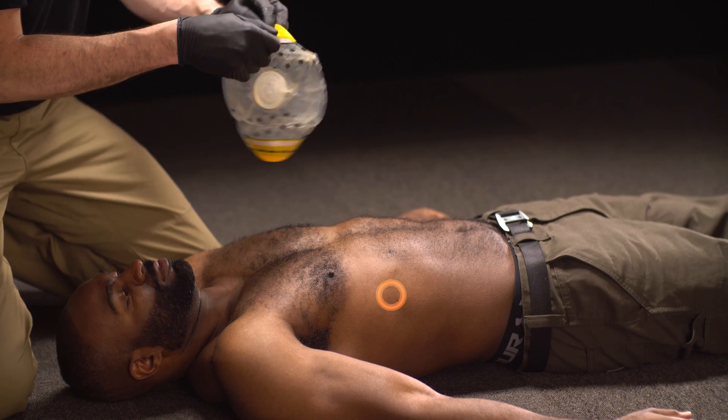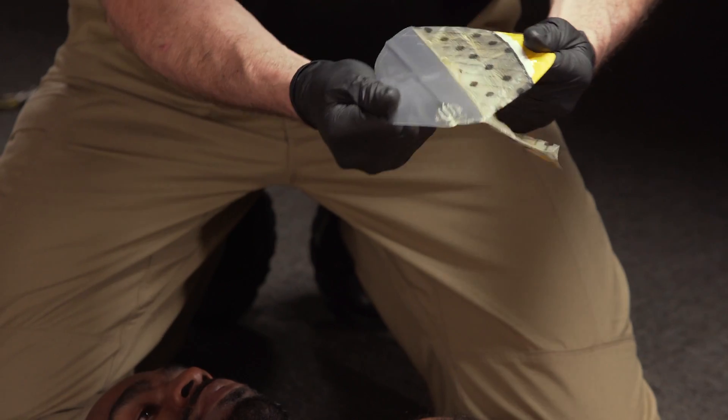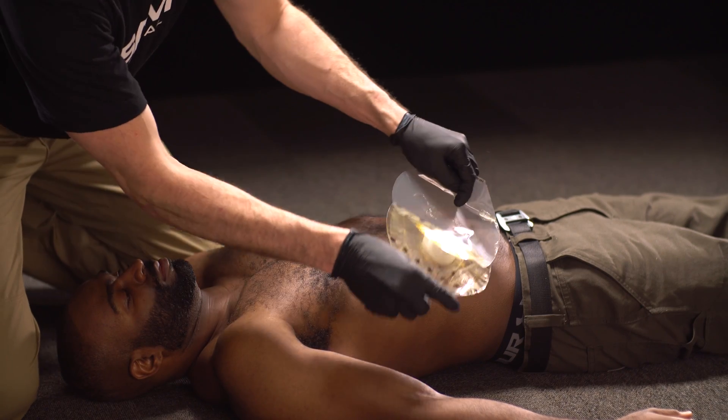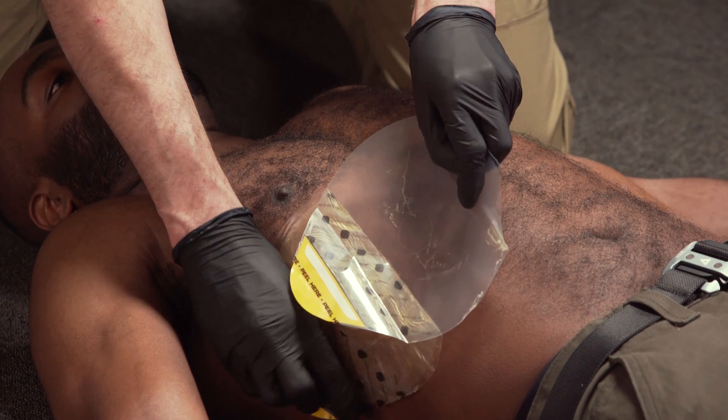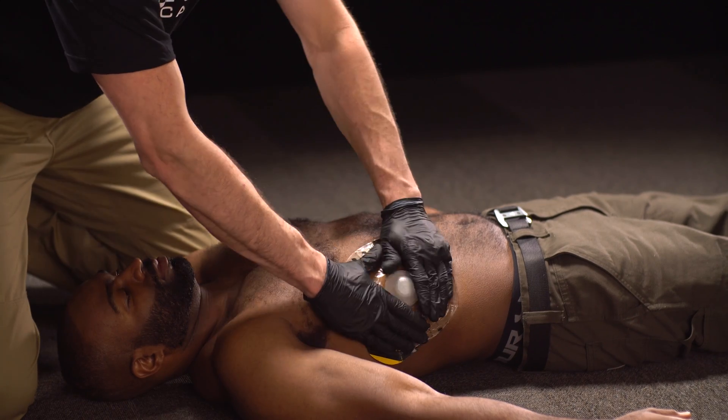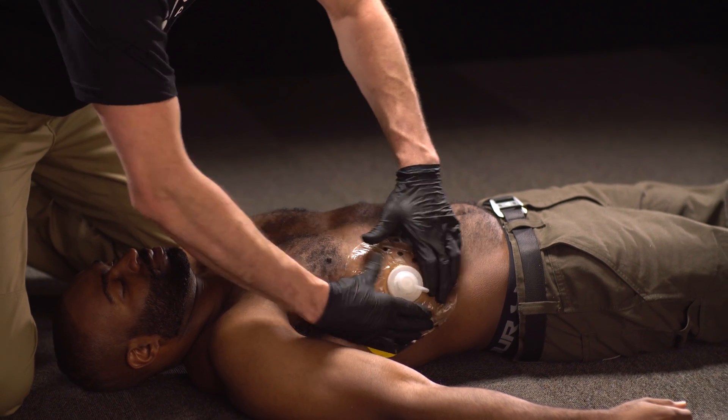Next, grip the application tab and remove the clear liner. Center the TrueFlow valve over the wound and place the dressing adhesive side down before pressing firmly across its entire surface to ensure adhesion.